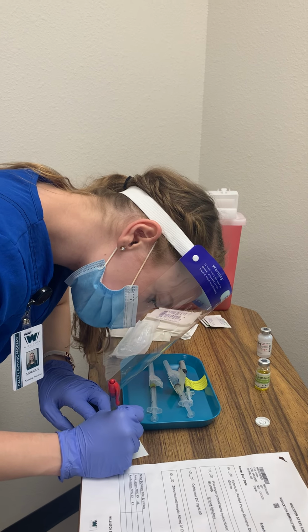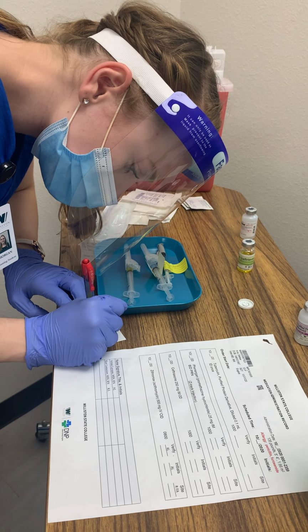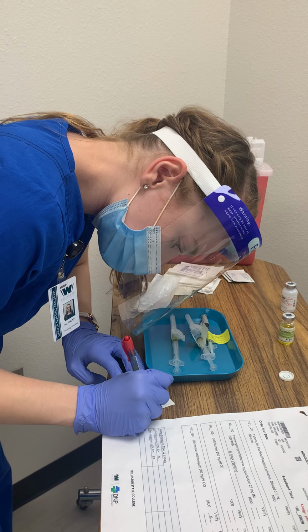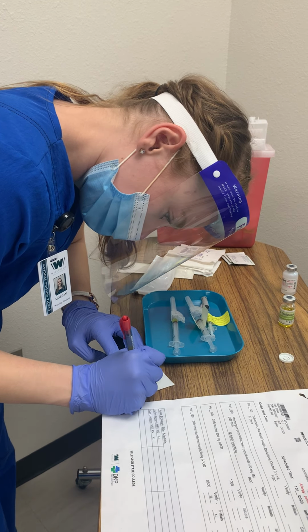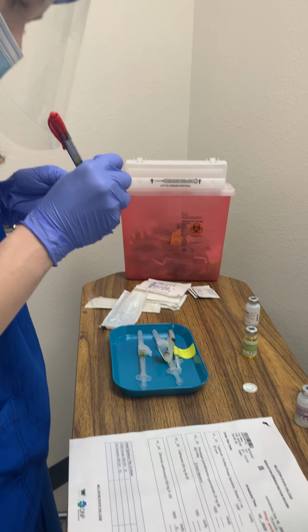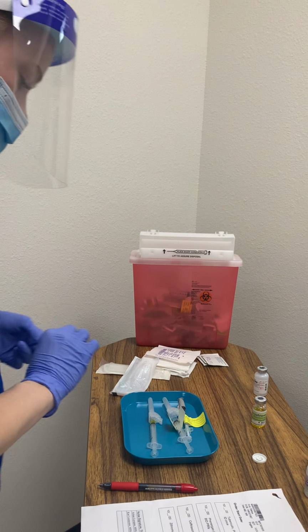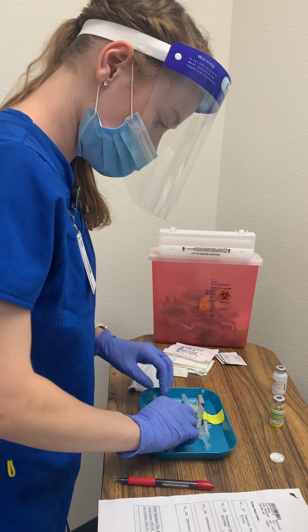So, NS, and then the date, 10/05/20, and then I've got the mils, 0.5. Here, let me just make that a little bit clearer. There we go. So, label. So that is my third check.